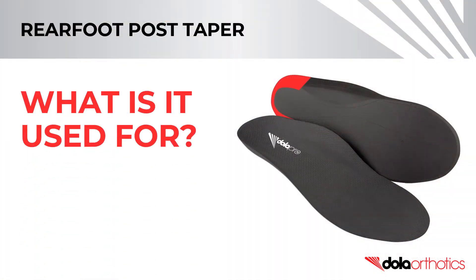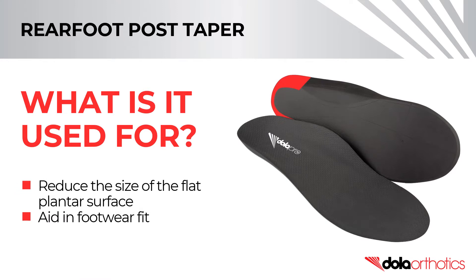A rear foot post taper is used to reduce the size of the flat plantar surface and aid in footwear fit, including football boots, cycling cleats, ski boots, dress shoes, high heels, street shoes, and narrow waisted sport shoes.